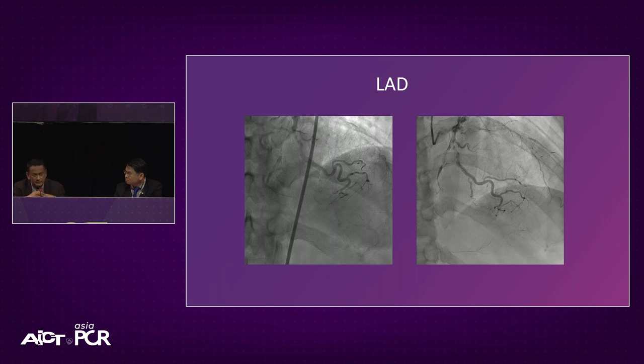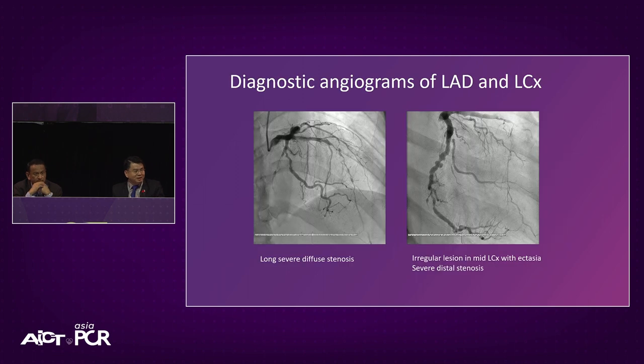So there are probably two different aspects, because obviously the 2.25 and less than that would pose a much more challenging aspect in terms of a long-term outcome. So in this case, I think in the basket small, they define it as 2.75. So I think when we say small, definitely two is small. Is 2.75 also small, Fahim?